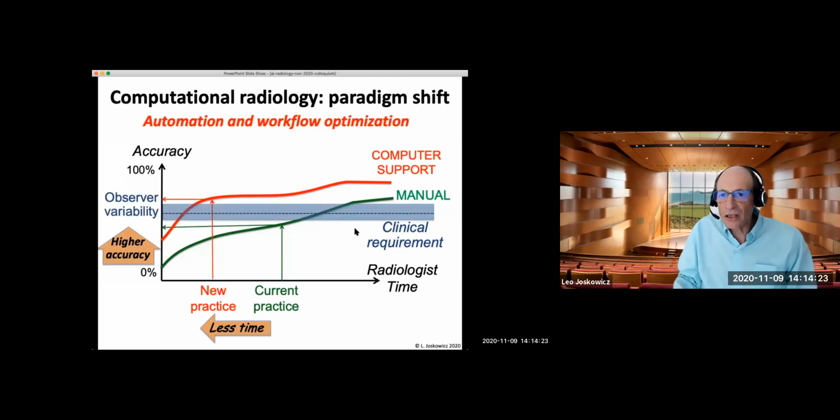But in addition, we want to talk about the observer variability. You have certainly experienced the case in which you ask one doctor one thing and then go to the next doctor and he or she tells you something different. And this might be perfectly legitimate simply because there's uncertainty in what different causes. So it is well known in radiology that there is something called observer variability, which means the different types of diagnosis or segmentations that can be derived from different expert radiologists. Think of this as a certain variability or uncertainty band, okay?